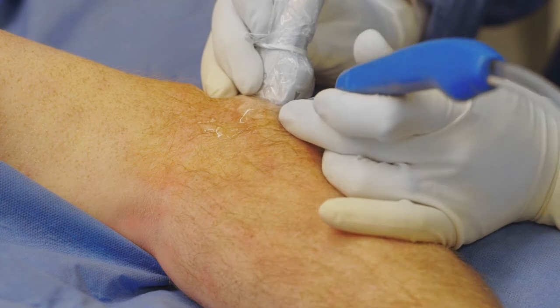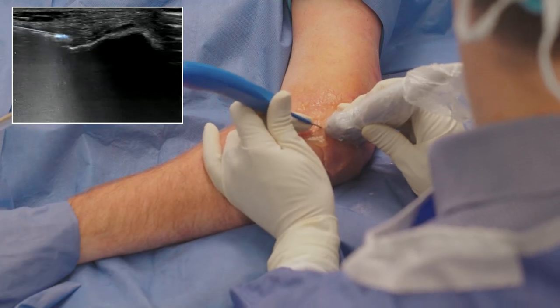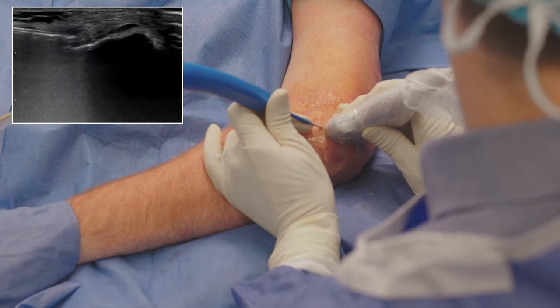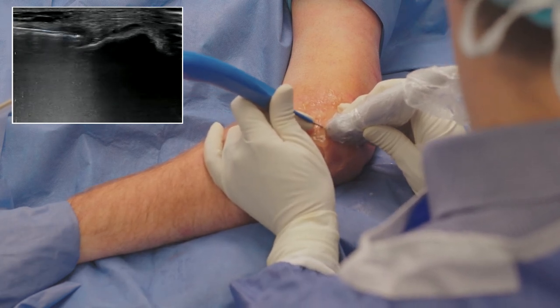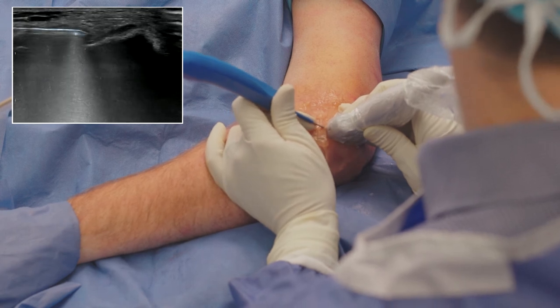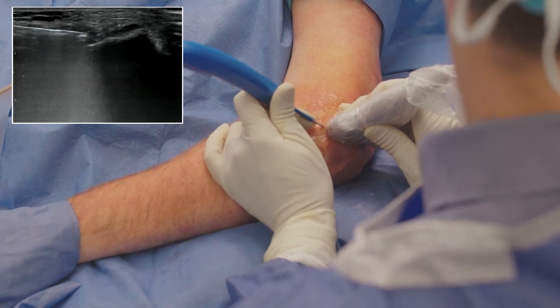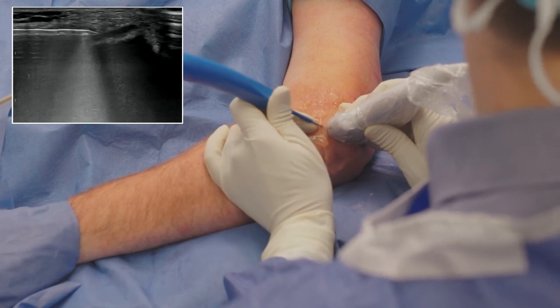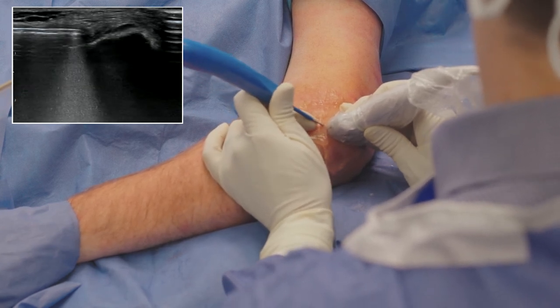On ultrasound, the white areas that you see are some of the artifact created by the saline jet cascading under the instrument, but the TenJet tip is very visible. I motion the device in a gentle pistoning motion forward and backwards, or rotate the device to reach all of the pathology that is causing pain for the patient.